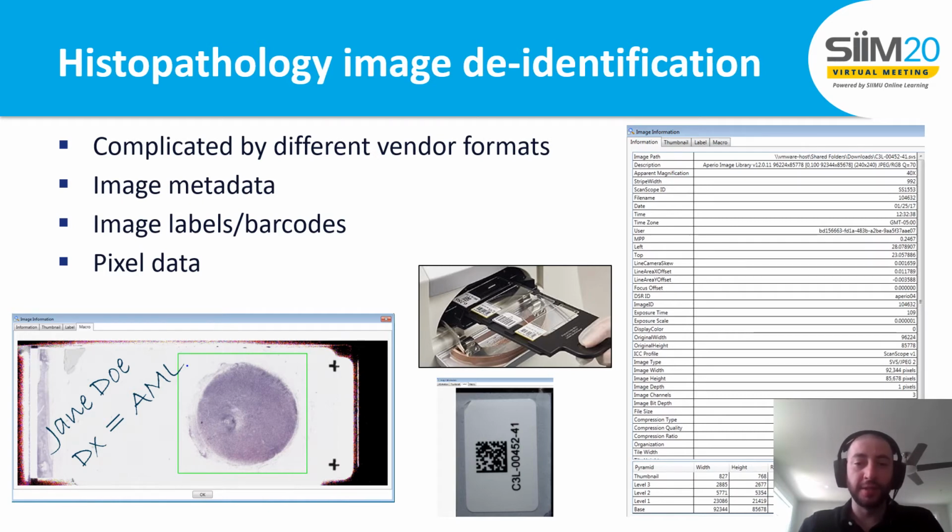Then in the middle, you'll see some examples of the barcodes that are attached to the slides. And so we also have to review those barcodes and labels and make sure there's nothing that looks like patient identifiers or any other kind of information there.